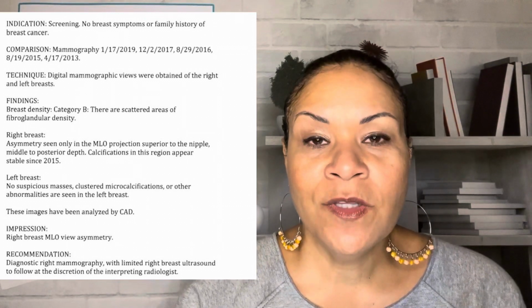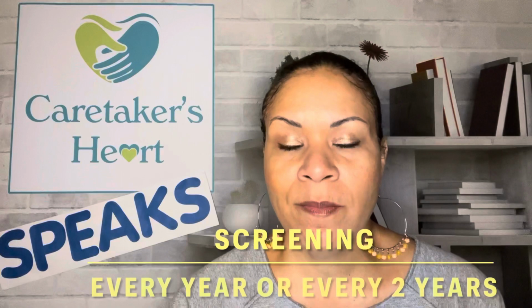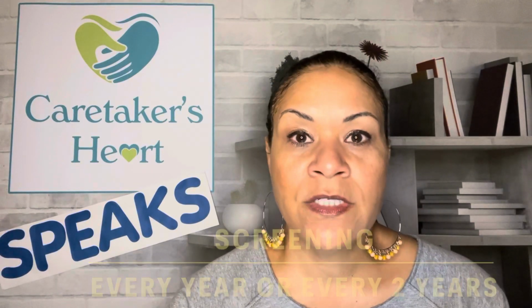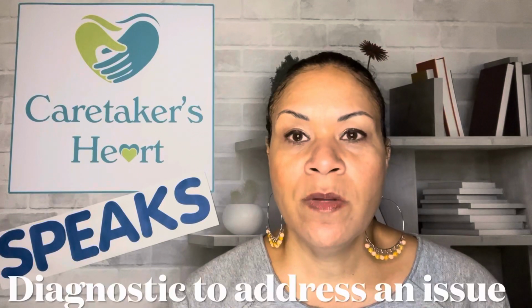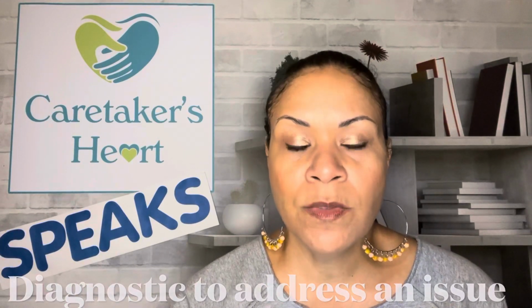At the very top of the report, it should say what type of mammogram you're getting, and it should either be a screening or a diagnostic mammogram. A screening mammogram is just a mammogram that you have every year annually or every 2 years. And a diagnostic mammogram is a type of mammogram that you may get if you're having a particular problem with your breast.